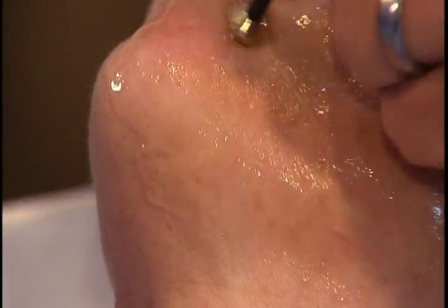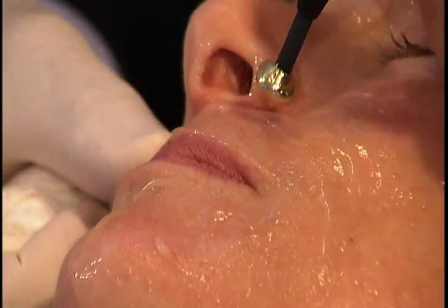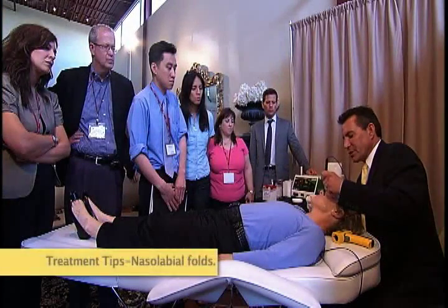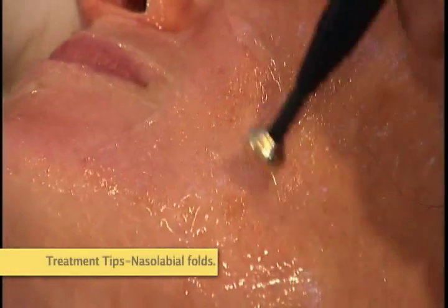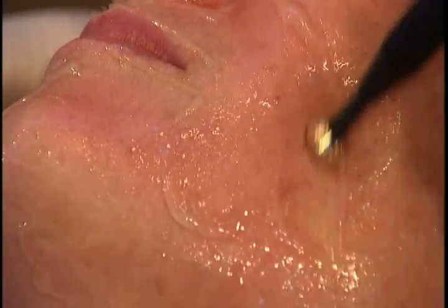So I want to work from the jawline. I'll start swooping under there in a little bit, and I circle the mouth. You can hold a little pressure from the other side on the lip lines. To reduce the nasolabial fold, we're going to start by heating the high side parallel to it and heating the fold itself. Reading her body language, knowing it's time to move on.